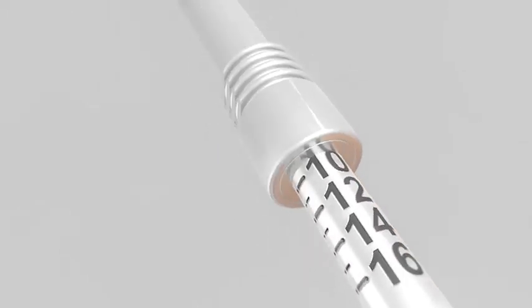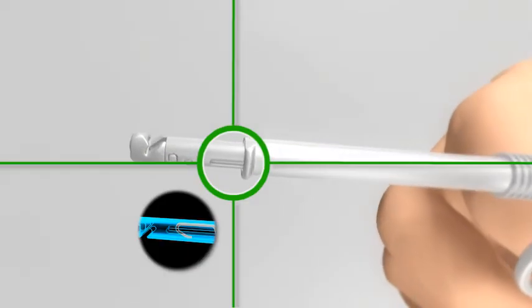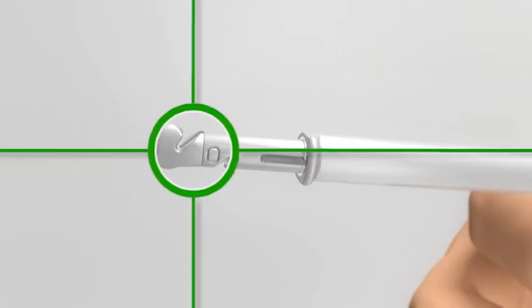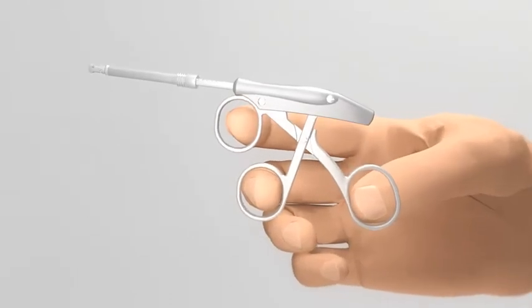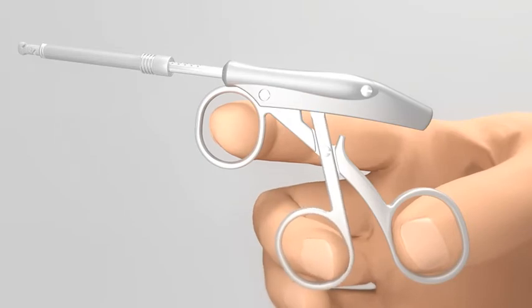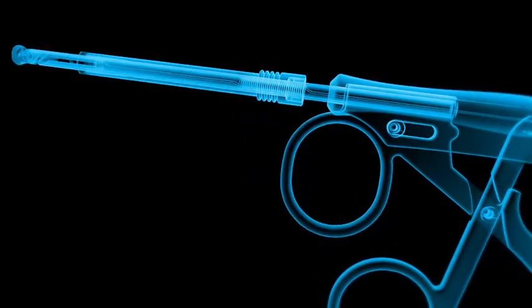Start sizing with the small device sizer. To load the sizer, you will use the loading hook, the loading notch, and the tip notch. The removal notch is used for removing sizers or devices from the ear canal. To begin loading the sizer, squeeze the moving tension ring as far as it will go towards the thumb ring. This will extend the loading hook forward towards the tip.